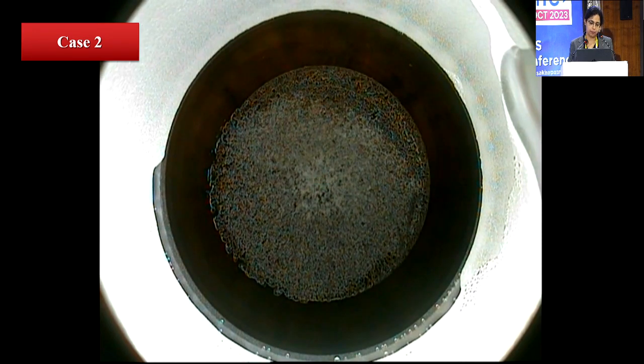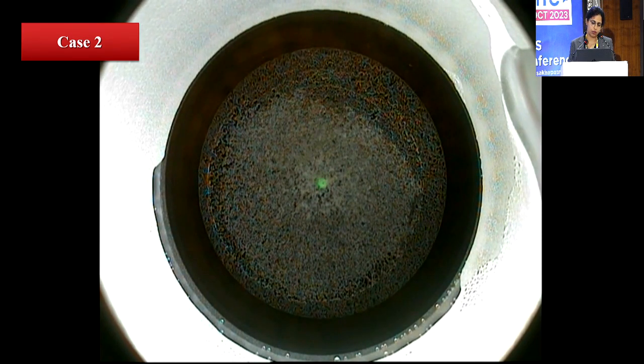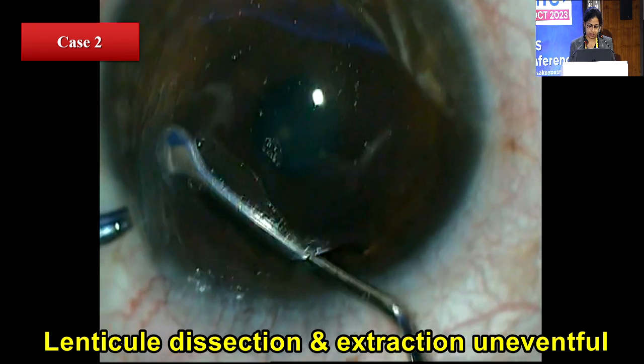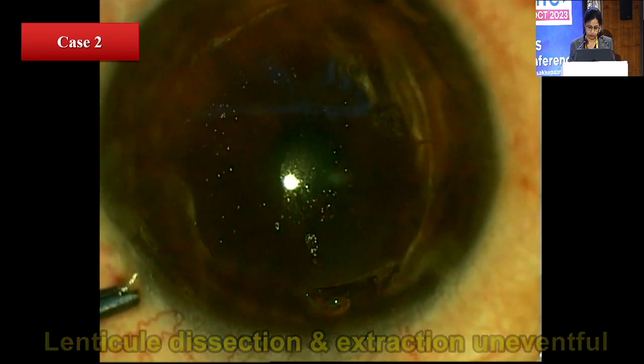However, if you can complete the laser uneventfully, then more or less lenticule dissection and extraction goes on fairly well. So the subsequent dissection and extraction in this case was uneventful.